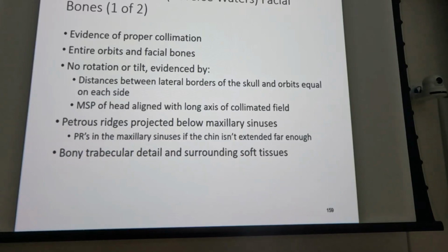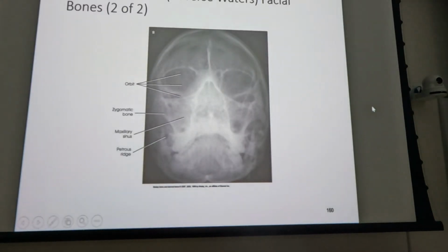Okay, so that's reference what that looks like. I think this is on a Phantom. The reason I say it's on a Phantom is because things just look kind of weird, right? I mean, they almost look like they got bilateral sinus infections. But what are you not seeing in the foramen magnum there?